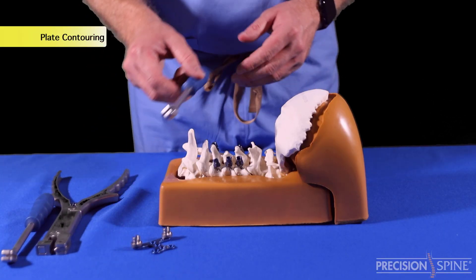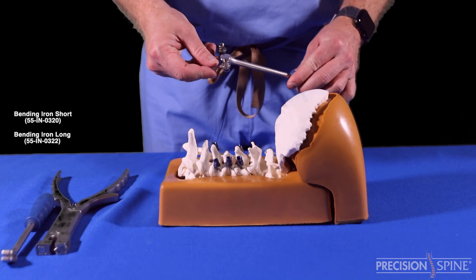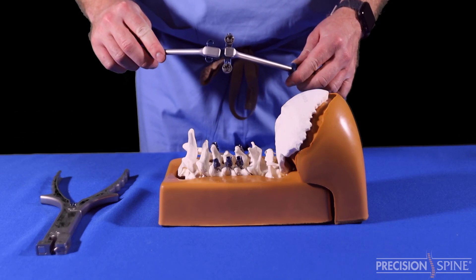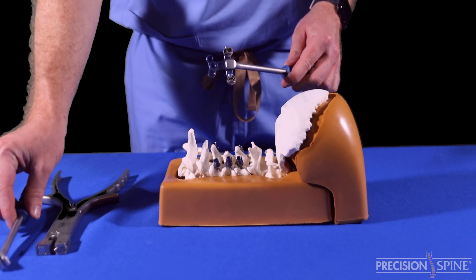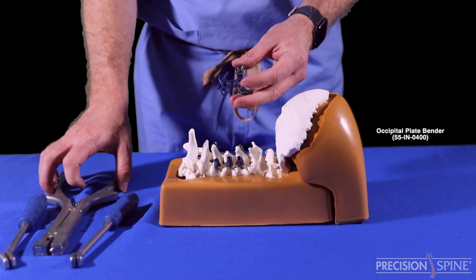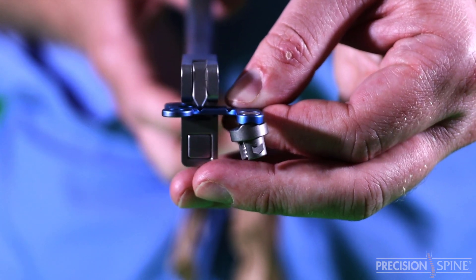There are two options for contouring the occipital plate. First, the long and short bending iron. These two instruments are used in tandem to contour the plate. The short iron has two small ball plungers to grasp the plate, and the long iron is positioned close to the contour zone that needs to be bent. Second, the occipital plate bender. Place the bender's wedge directly over the contour zone and squeeze the bender.